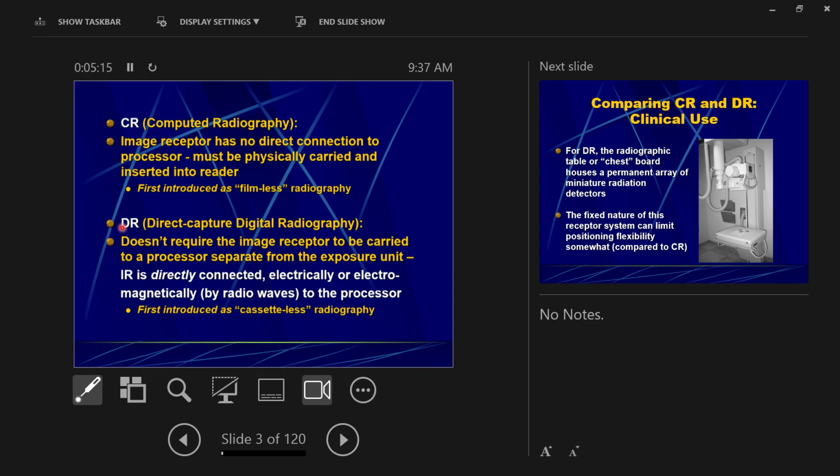They're just a different kind of light, okay? They're a kind of light that you cannot see. You don't have any sensory perception for it. You can't see it, can't feel it, can't taste it, can't hear it. And they pass through your body without you knowing it. And because they pass through your body, we can take images of the shadows of the inside of the body, right? Pictures of bones, in other words.